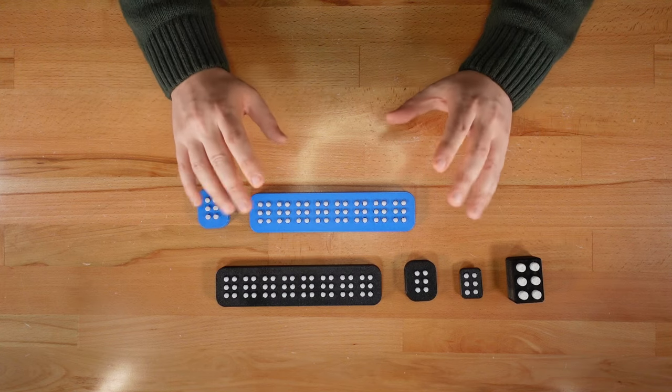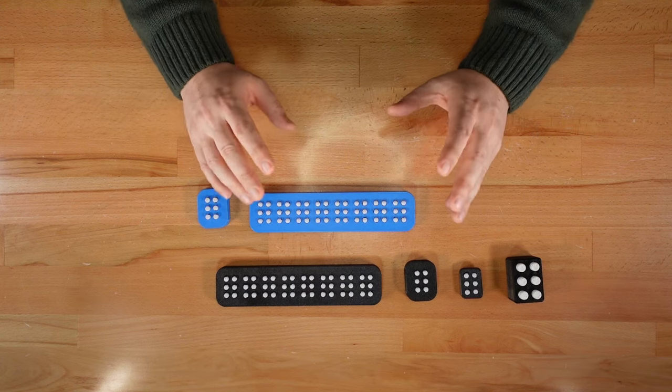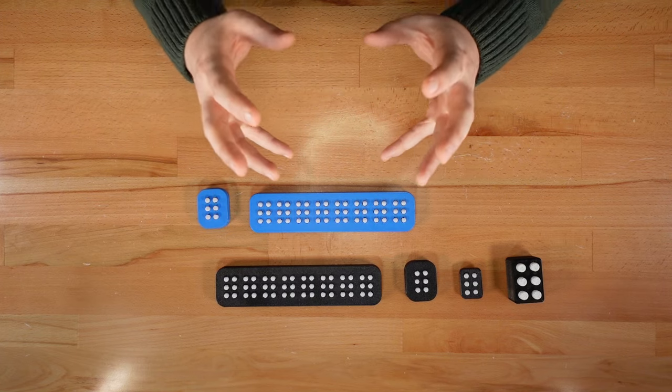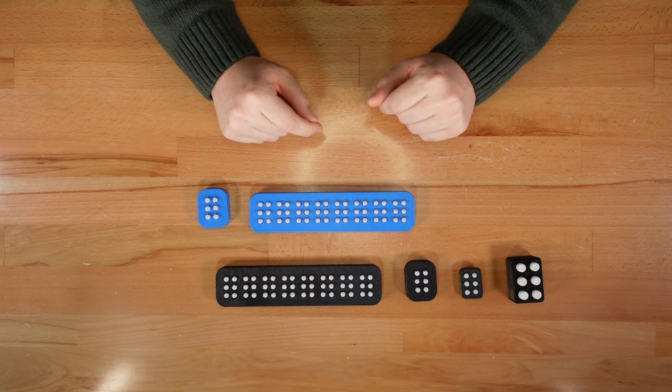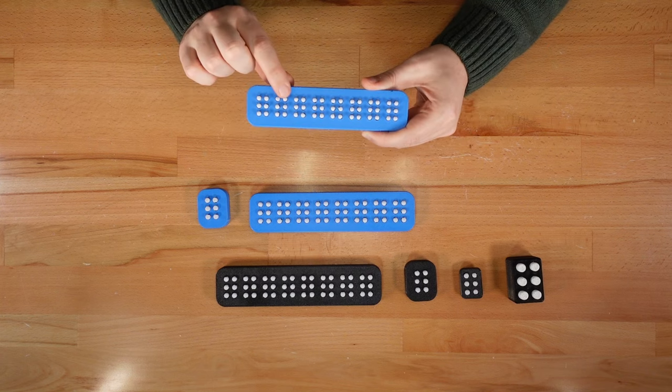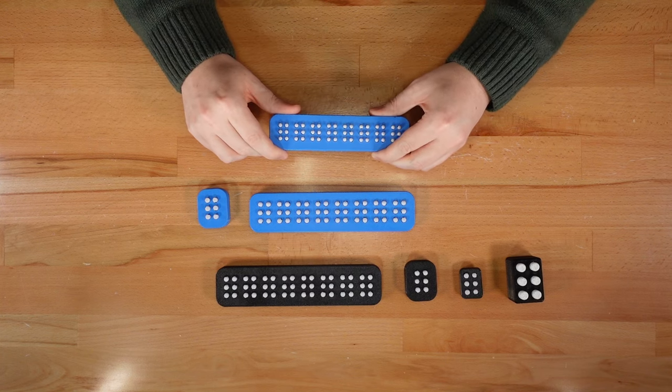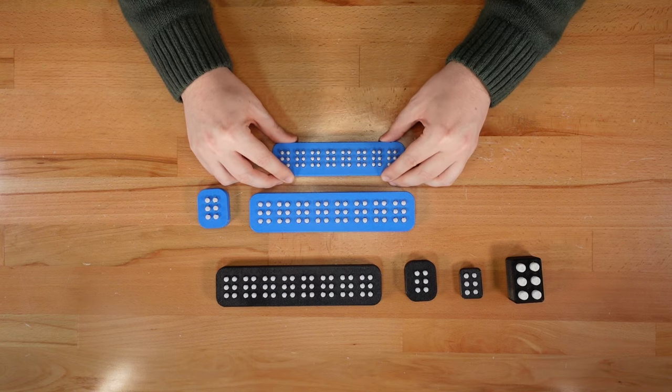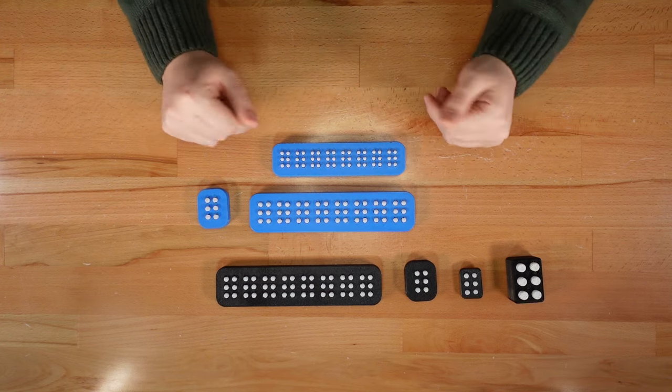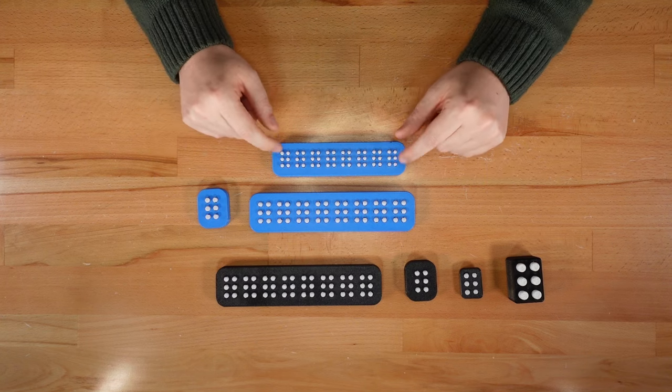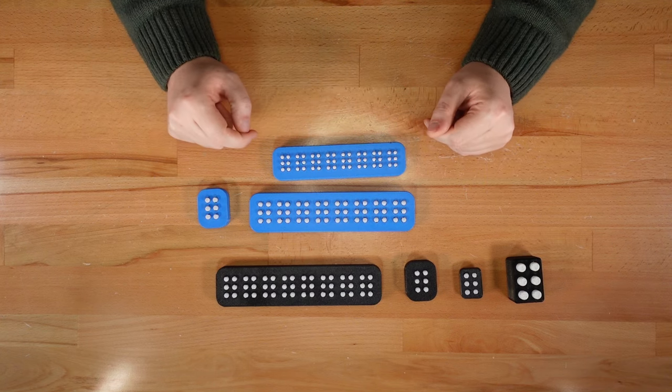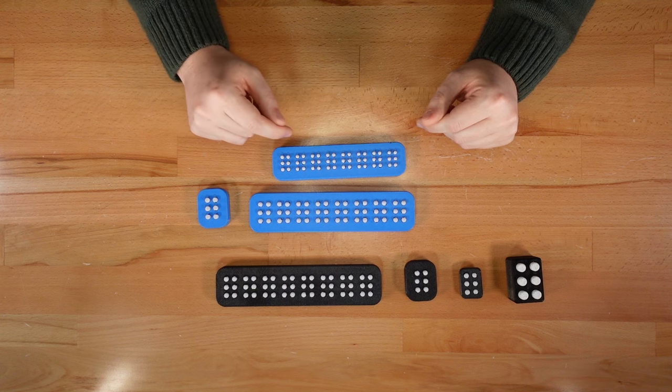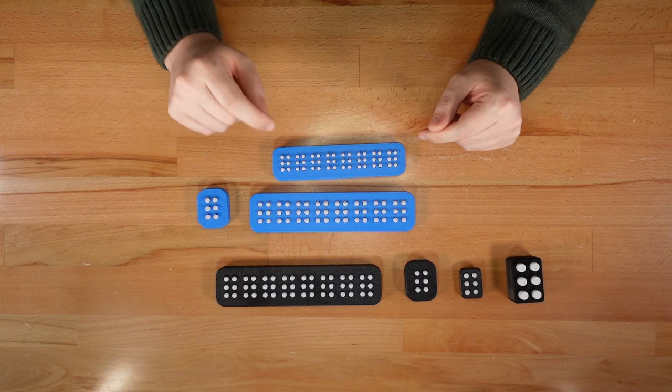In addition to these functional improvements, I have another customization option to share. This simpler mechanism makes it possible to shrink the braille cell down even more. This print has 4.5 millimeter buttons instead of the default 6 millimeter ones. That's another 25% reduction in size. This might be a good option for portability or as a step toward reading smaller braille text. Of course, we might be able to go even smaller, so keep an eye out for future remixes as I continue to work on this design.